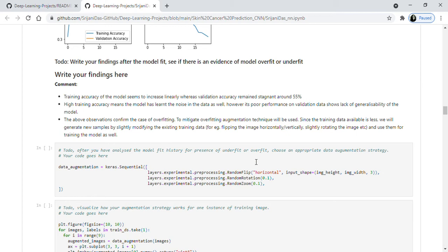For data augmentation, we used layers.experimental.preprocessing with horizontal random flip, random rotation — which rotates the original images slightly — and random zoom. These are the variations we used. It will create some new images, and from those, new datasets will be created, so we'll have more data to train our model on.